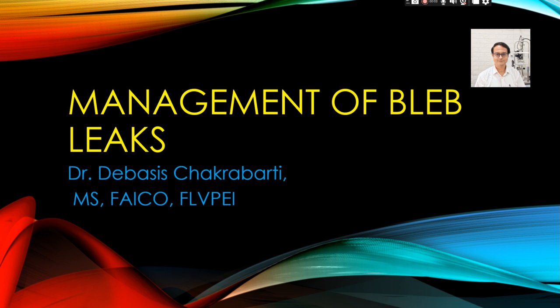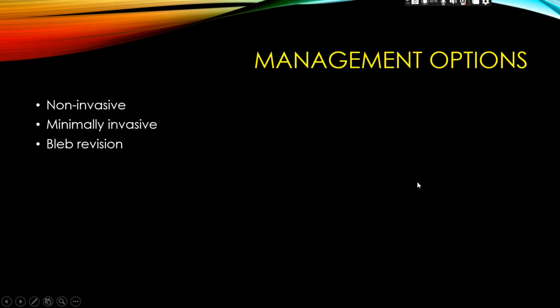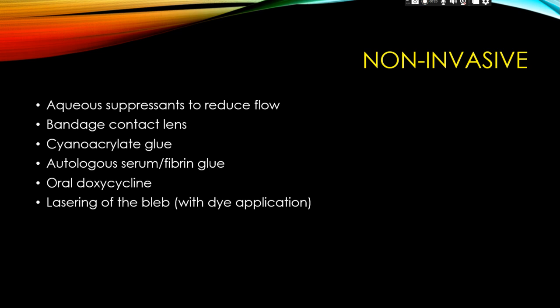Hello everybody. I will discuss a simple technique for the management of bleb leaks. Bleb leaks, as we all know, can have disastrous complications like bleb-related endophthalmitis. The various options for treatment of bleb leaks are non-invasive, minimally invasive, or bleb revision.